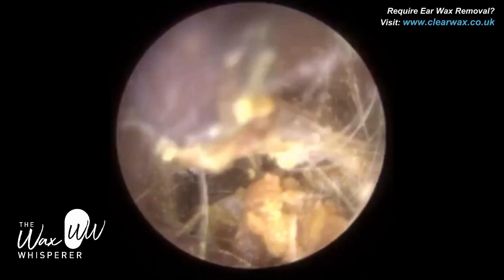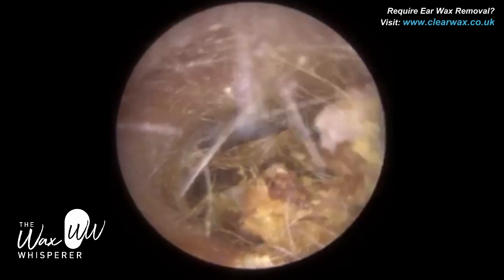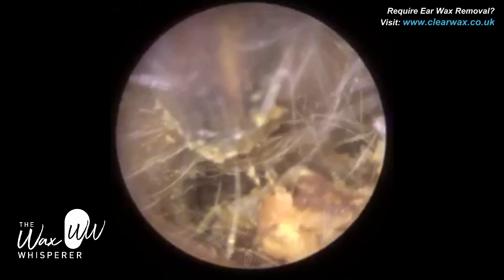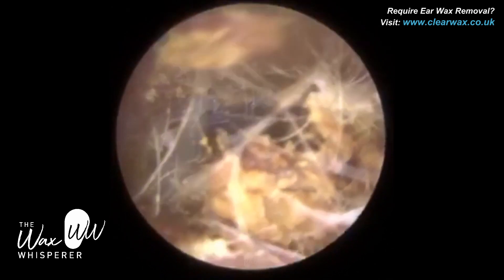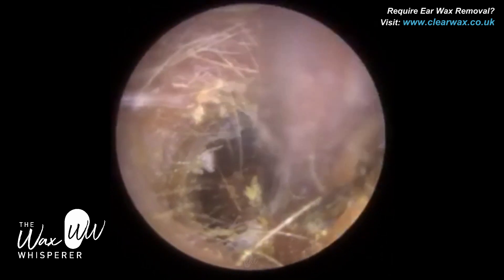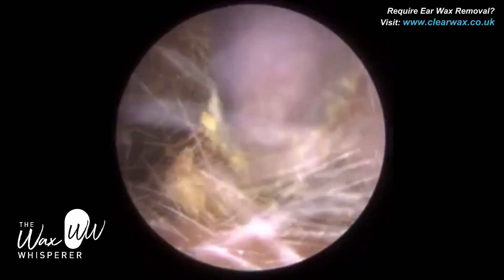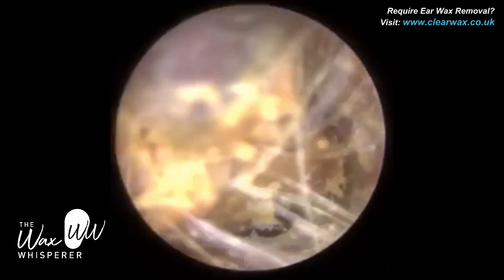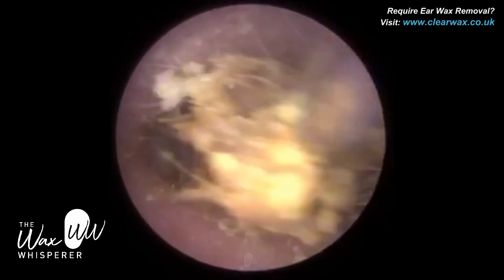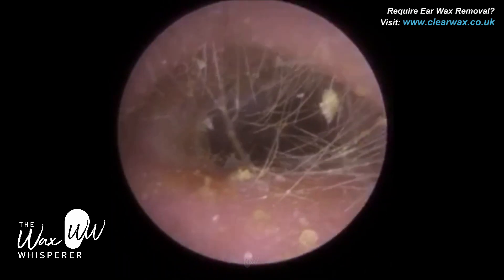It's playing tug of war against me. So whenever you've got a lot of dead skin keratin, it's always advisable to try to peel that off the canal wall itself, which enables the plug of wax to be immobilized and removed. You can see that layer of dead keratin at the roof of the ear canal has more or less been removed. So I'm just lifting this plug of wax from the base of the ear canal now, just wriggling it, and the outer part of this plug has been removed.